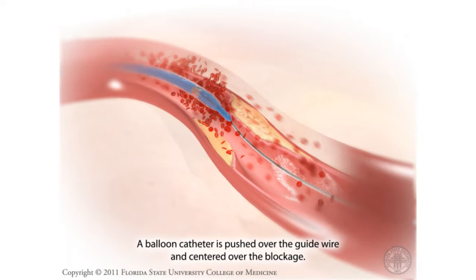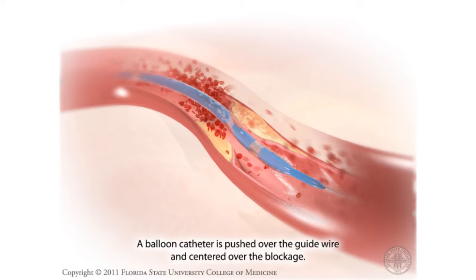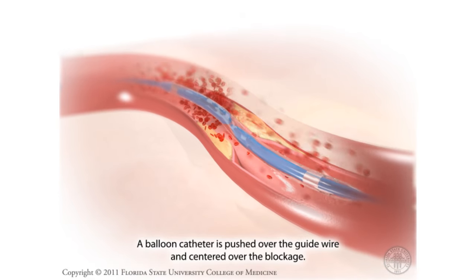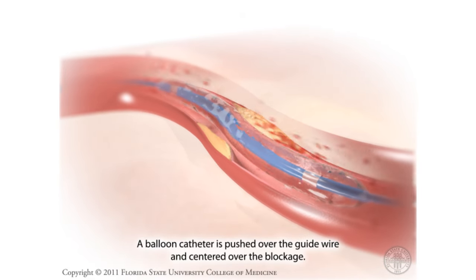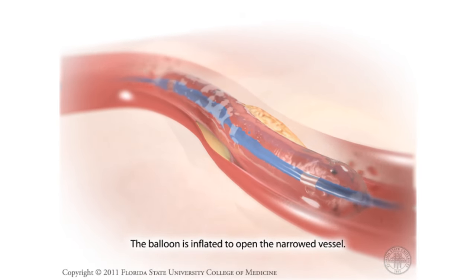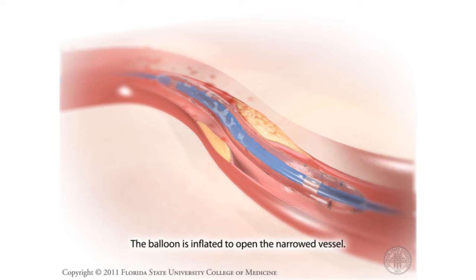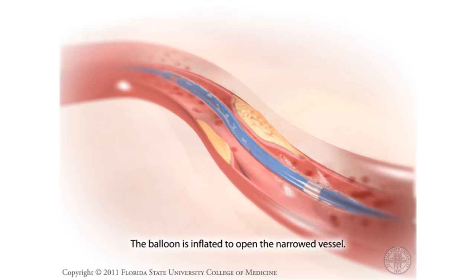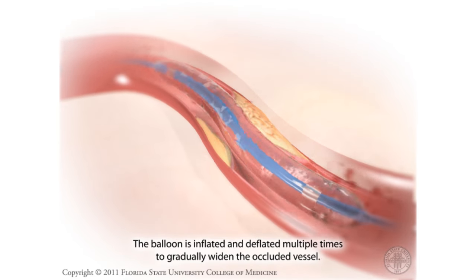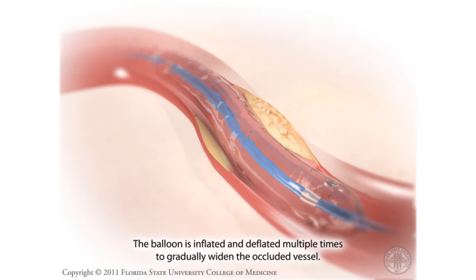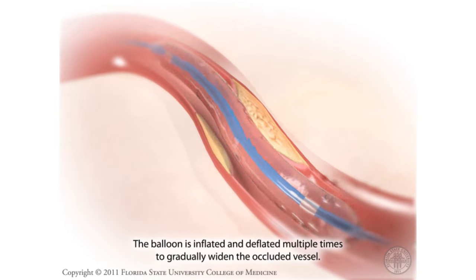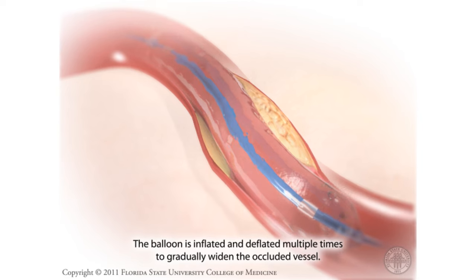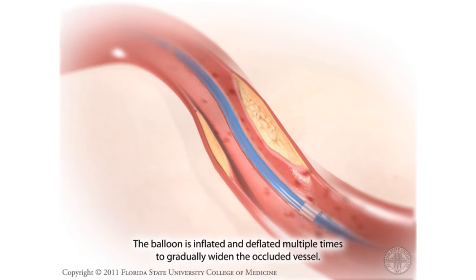A balloon catheter is pushed over the guide wire and centered over the blockage. The balloon is inflated to open the narrowed vessel, and is inflated and deflated multiple times to gradually widen the occluded vessel.